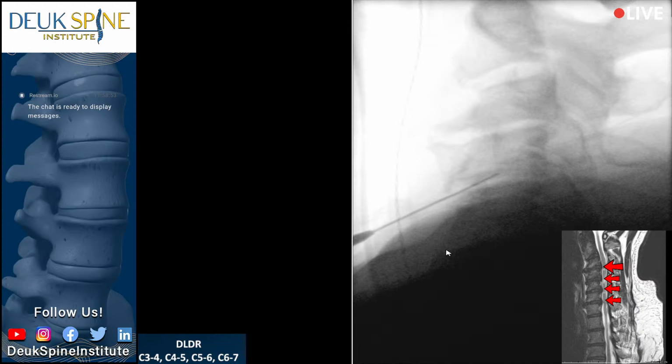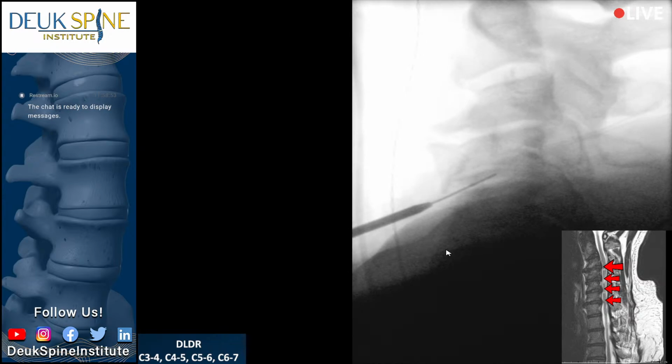Endoscopic surgery, just so you know. Let's go ahead and run our video animation. Flynn, show the audience first of all, why do herniated discs cause pain? It's due to inflammation. Show them that video as we get into this first disc.